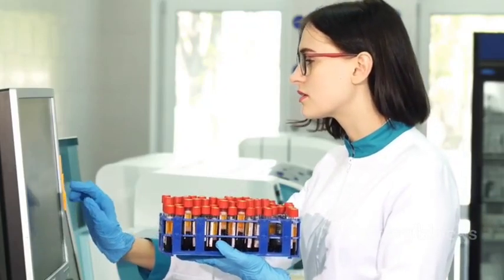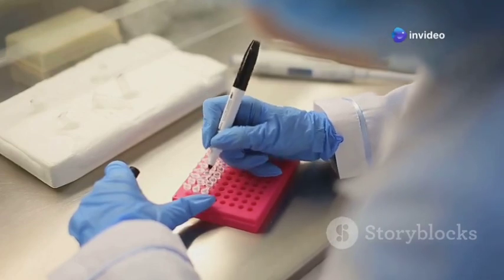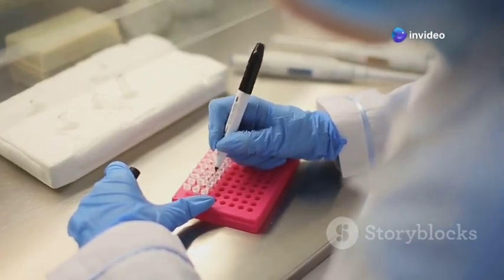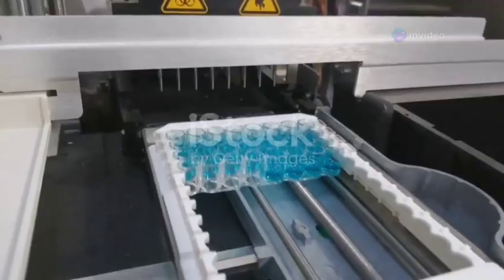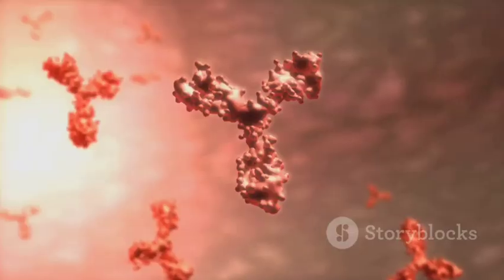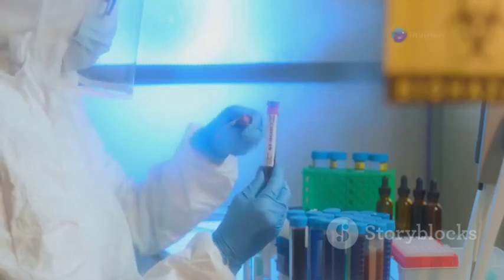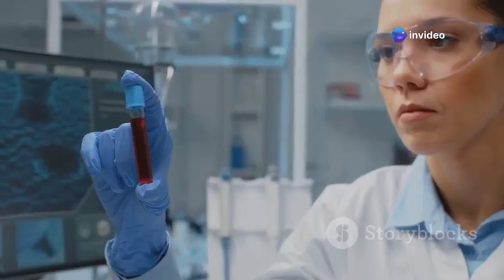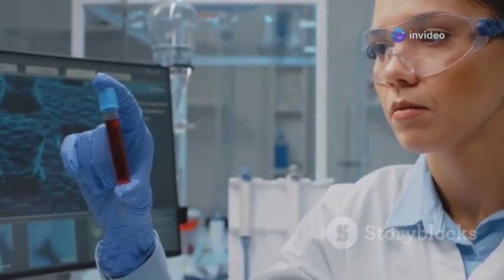Now, ELISA isn't just one test, it's a whole family of tests. Each test is designed to detect specific antibodies or proteins associated with different infections. Let's look at a few examples. First up, we have IgM ELISA. IgM antibodies are the first responders of our immune system. They appear early on during an infection, so if you test positive for IgM antibodies, it usually means you have a recent or current infection.